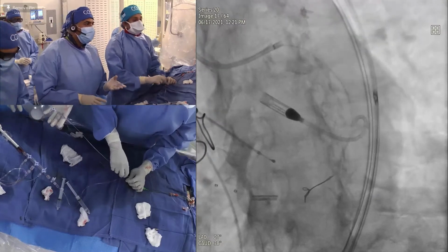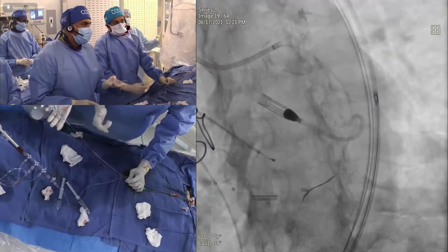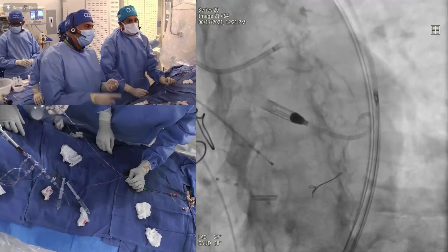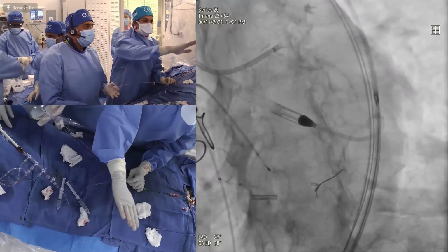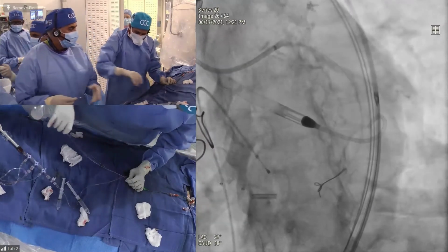Okay, good. Now we are going to cover the OM. Right now, so we will start with the 3-0. What stent do you want? 3-0-38? Yeah, 338 Zion. Do you want to stent into the LPL or the Zion? No, we're not touching it. After the OM, wherever we dilated, from there, come up to the left main. Okay. Yeah, it's a pretty big dissection.